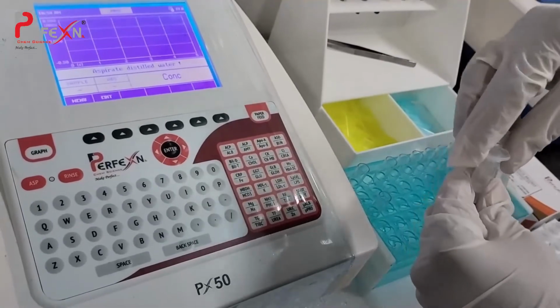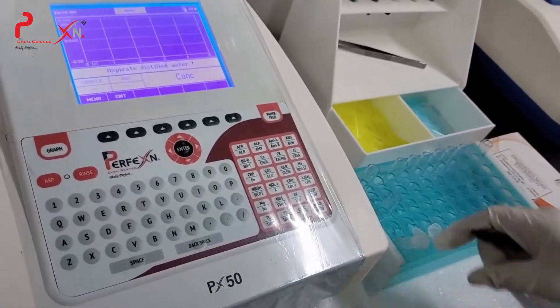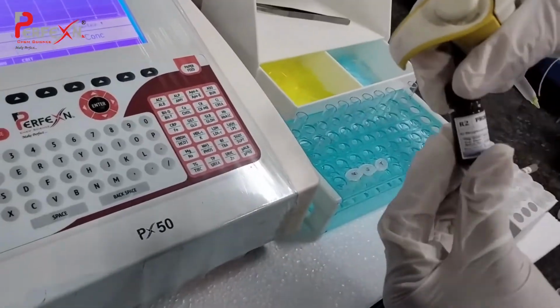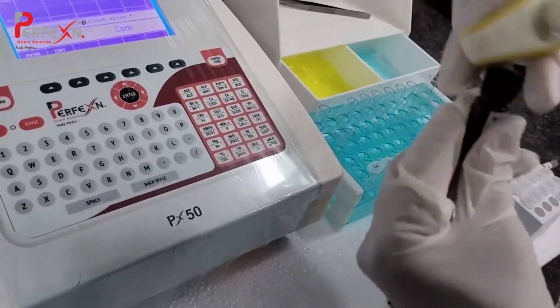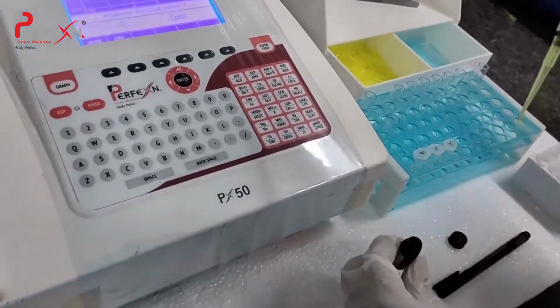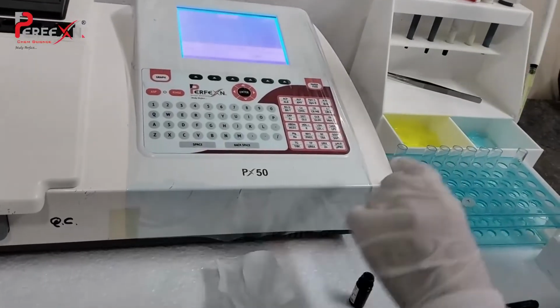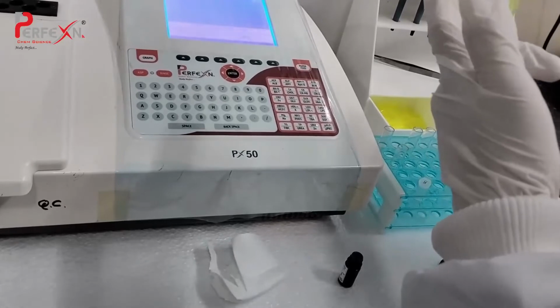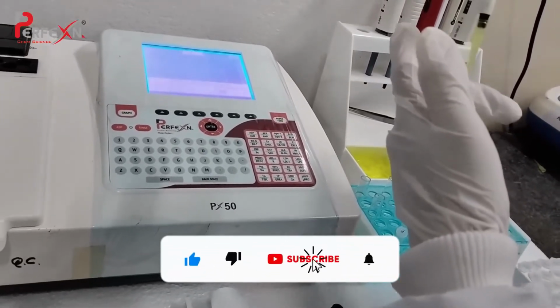Here I am taking 3 monovials and labeling them as blank, standard and test. This is the standard of phosphorus, which is of 5 mg per dL concentration. Here I am taking 10 microliter of standard. Wipe the excess amount and mix it in the standard vial of the phosphorus. Mix it well and incubate for 5 minutes at 37 degrees Celsius.